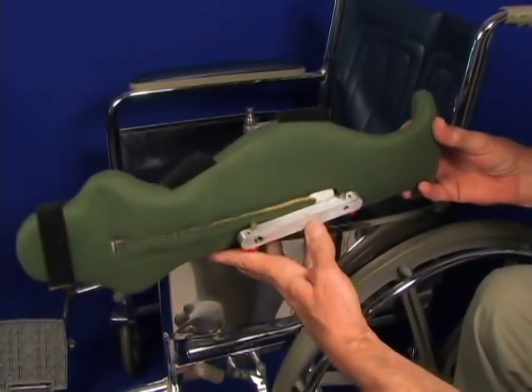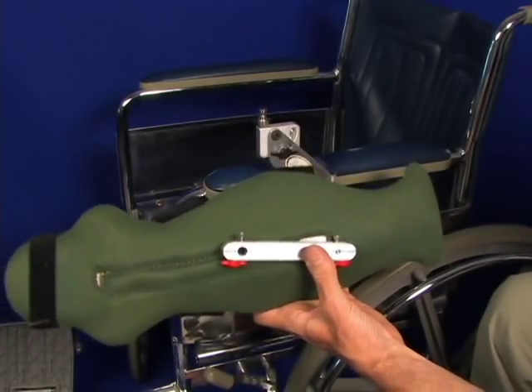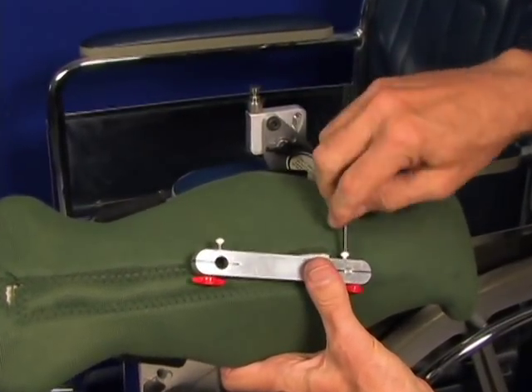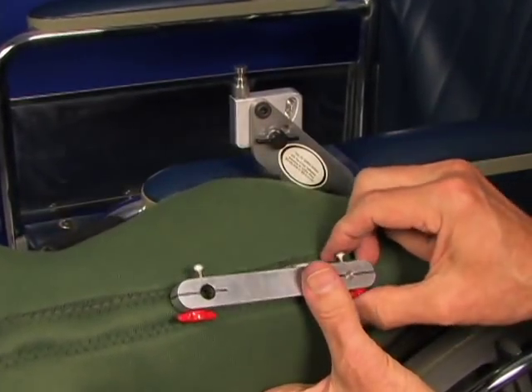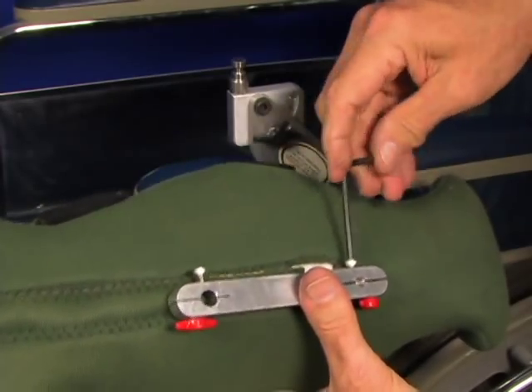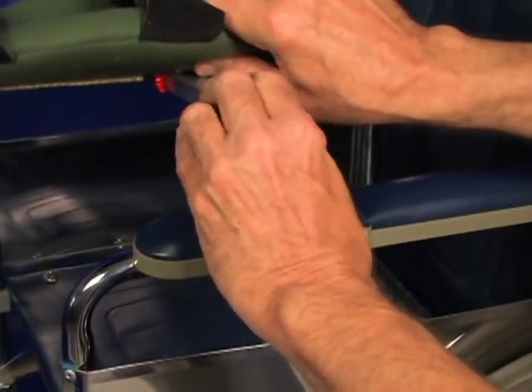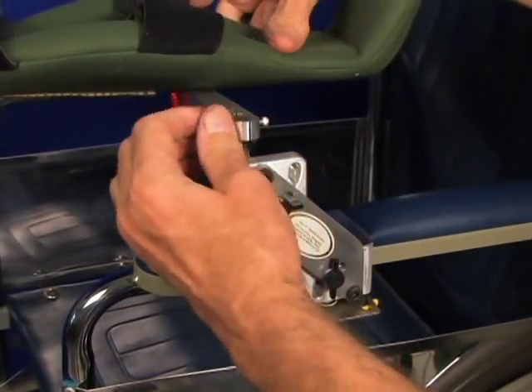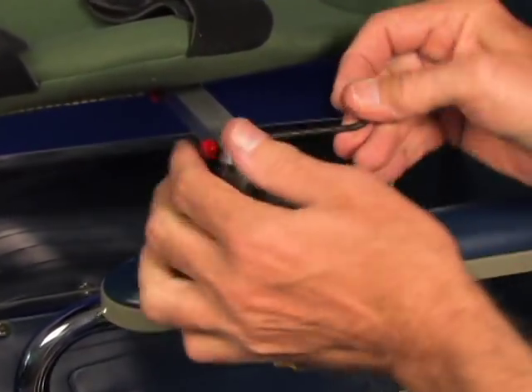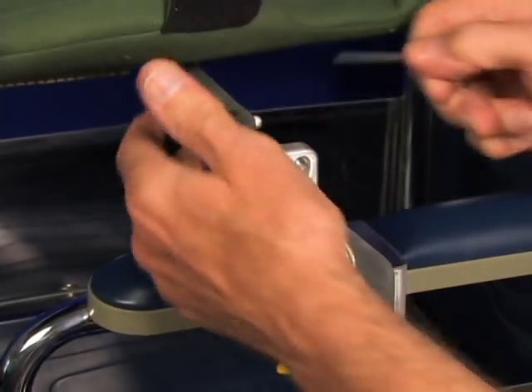This is the integral WHFO arm tray, and there are two adjustments here. These are locking adjustments that fit into the slot of the stud below it, keeping it from coming apart. This one goes onto the slot on that upper post and drops down on there — same situation. You lock it there. You want to push that into the slot of the stud that's sticking up so that it won't come off.